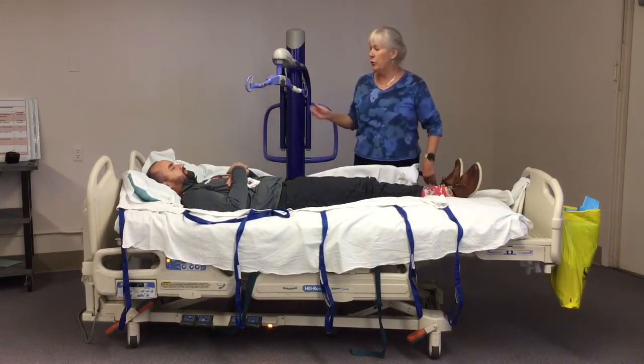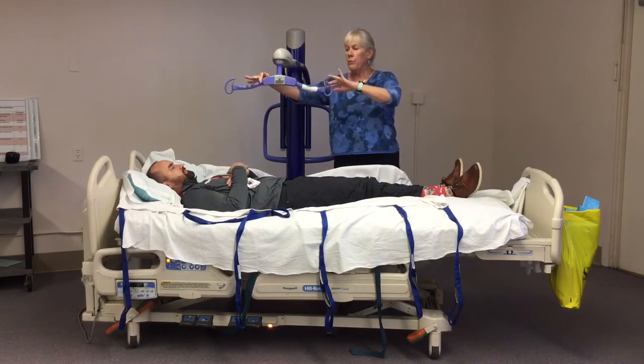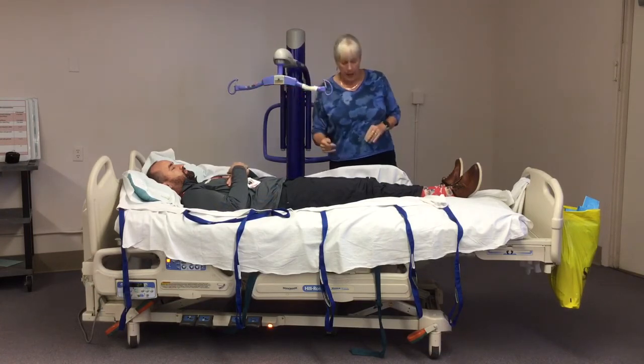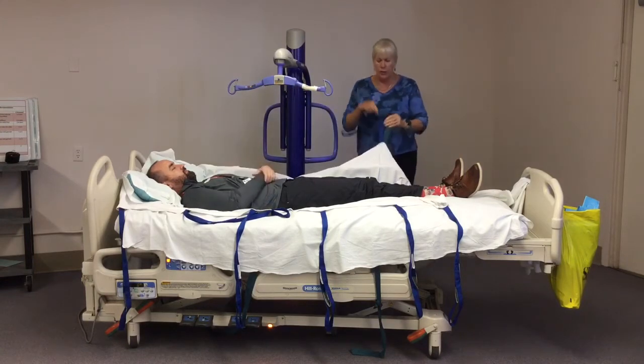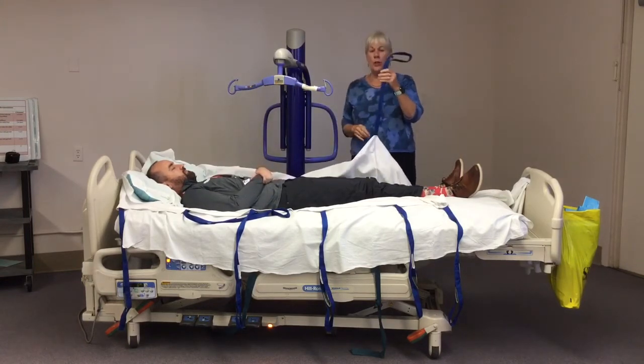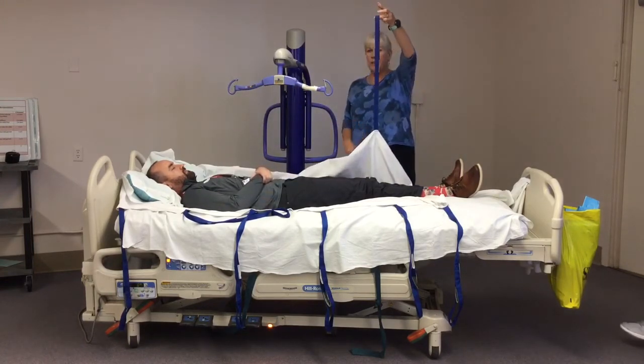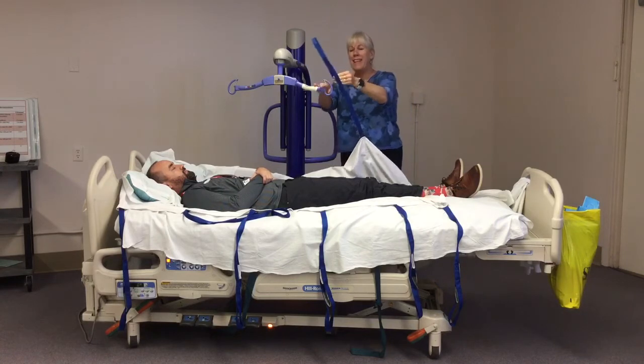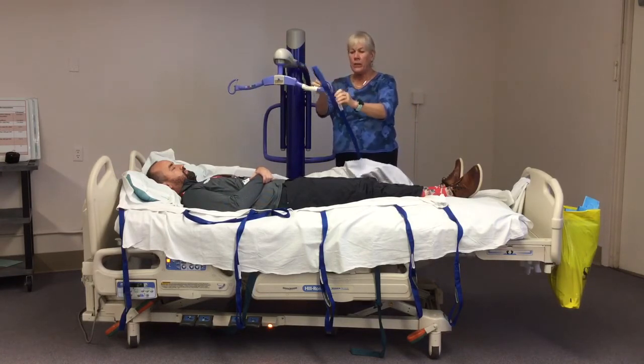I turn my 2-point spreader parallel to the patient. And now in terms of choosing what color I'm going to use, if I use blue, you can see how high I have to lift him up. So I'm going to use the one that's the lowest, but yet I can still reach, okay? So in his case, I might try the gray.